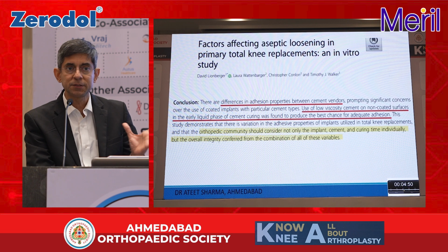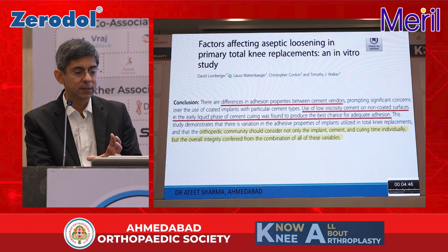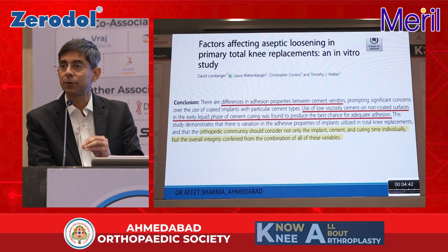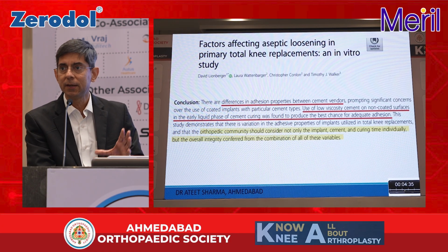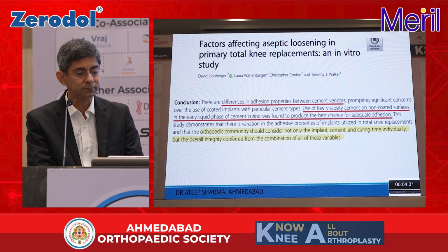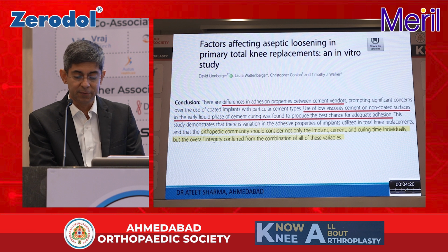And this is an important point: use of low viscosity cement on non-coated surfaces in the early liquid phase of cement curing was found to produce the best chance of adequate adhesions. Presently, what we are all using are high viscosity cements, and this study shows that low viscosity cement is better. So, the orthopedic community should consider not only implant, cement and curing time individually, but the overall integrity conferred from the combination of all these three variables.